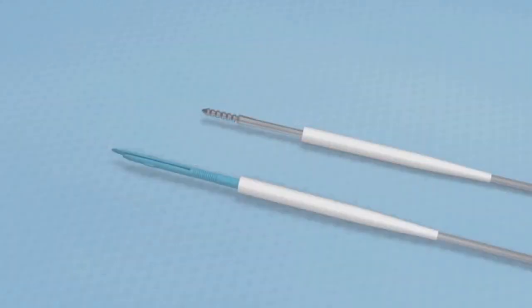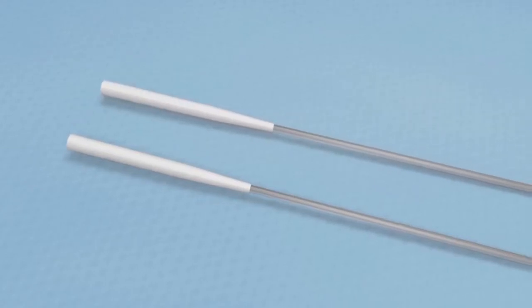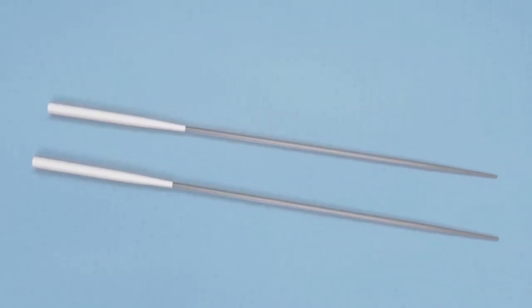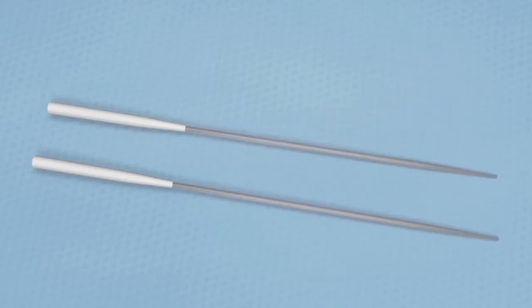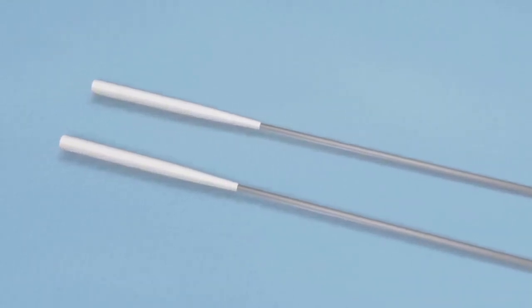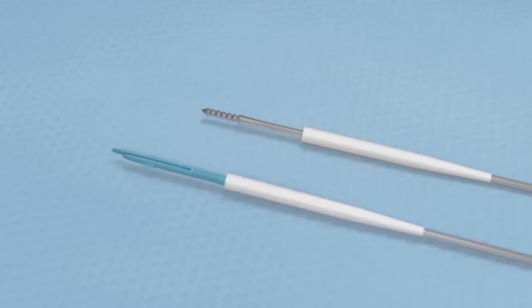The unique bifurcated tunneler for the Palindrome Precision Chronic Catheter is designed to ensure secure catheter placement, with a unique sheath and node system that greatly reduces the risk of catheter detachment from the tunneler when tunneling in the subcutaneous tissue. The tunneler supplied with the MAHURKAR 14.5 French chronic catheter is slightly different in design, but also provides a low-profile sheath to minimize the tunnel tract size, and it is also malleable for user customization.